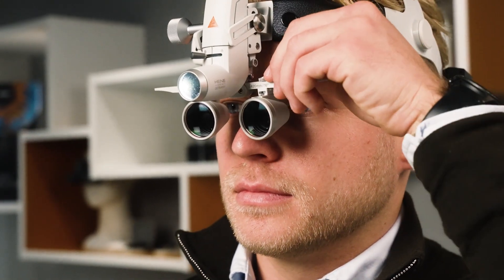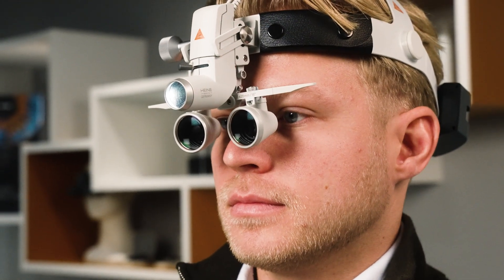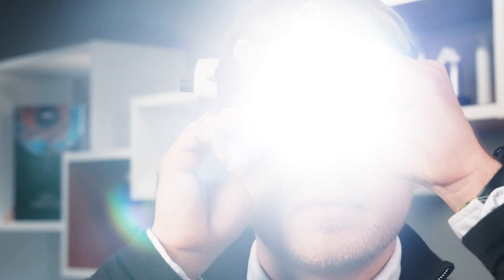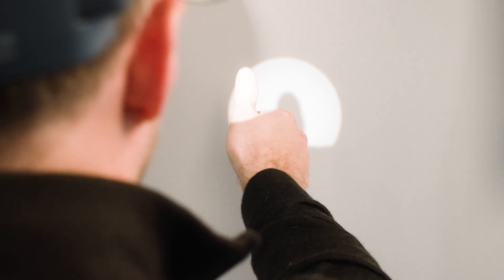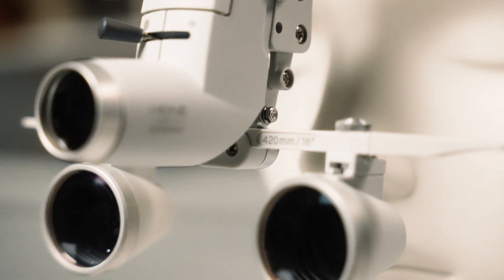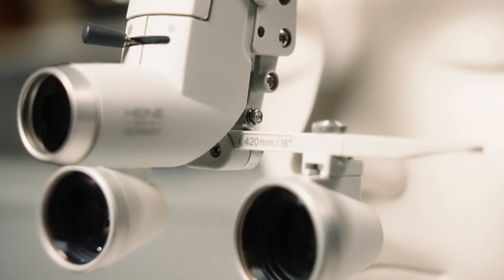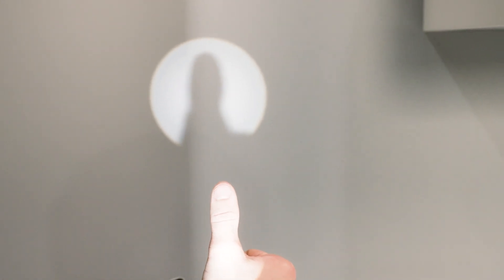To make sure the magnified field of vision is perfectly illuminated, you may slightly adjust the headlight to your individual need and preference. Now we can check if everything is perfectly adjusted. To do this, hold out your thumb at approximately the working distance of the loops — the millimeter number on the carrier rail that we looked at in the beginning of the video. You should be able to see your thumb clearly and distinctly in the full spot of light.